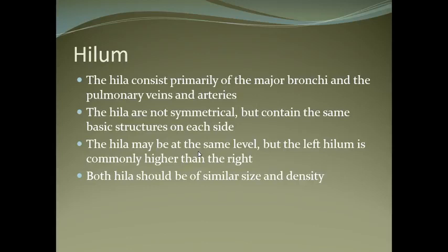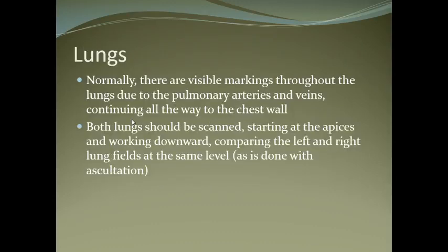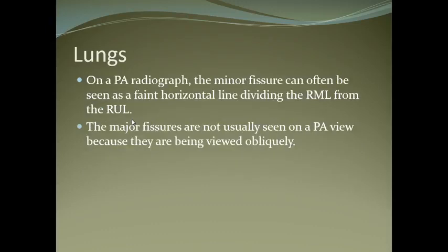The left hilum is usually higher than the right, but both should be of similar size and density. Lungs show vascular markings throughout, due to pulmonary arteries and veins, continuing all the way to the chest wall. Both lungs should be scanned from the apex downward, comparing left and right at the same level. The minor fissure can often be seen as a faint horizontal line dividing the right middle lobe from the right upper lobe. The major fissures are not usually seen on the PA view because they are viewed obliquely.